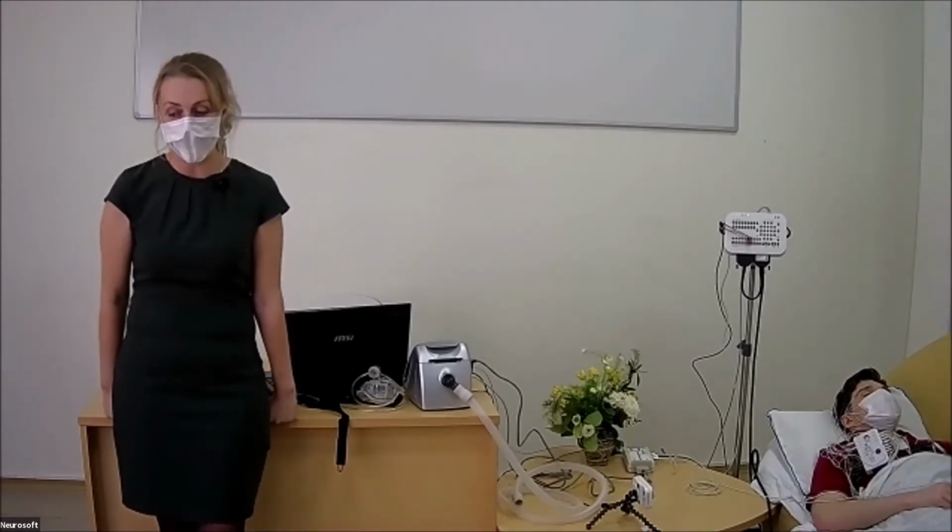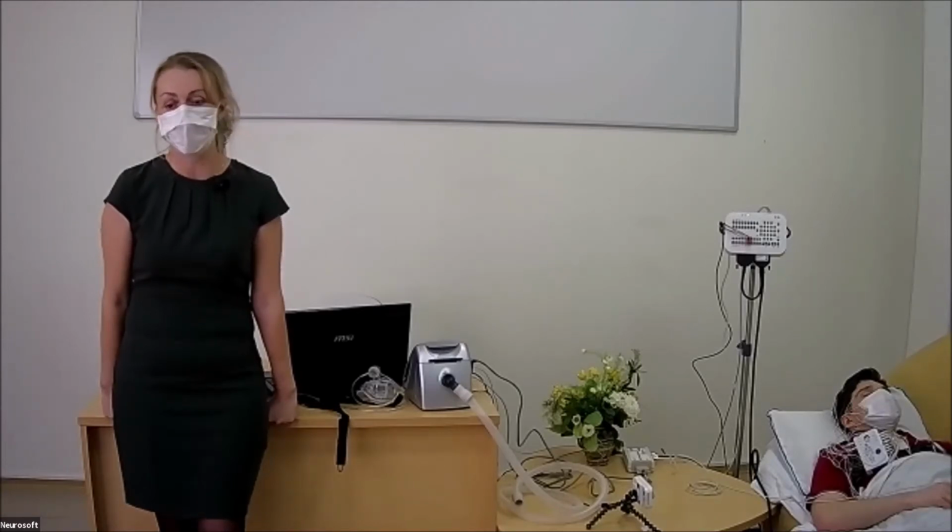So what are we doing during this test, and why do we need to perform it? The problem is that the value of the pressure which prevents the obstruction of the upper airway is different in different patients. So the effective pressure which prevents the obstruction could be different. Some patients have an effective pressure of 5 centimeters H2O. Other patients have an effective pressure of 10 centimeters H2O. And it is very important to find this effective pressure value.